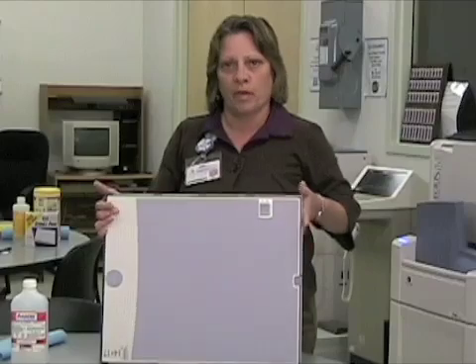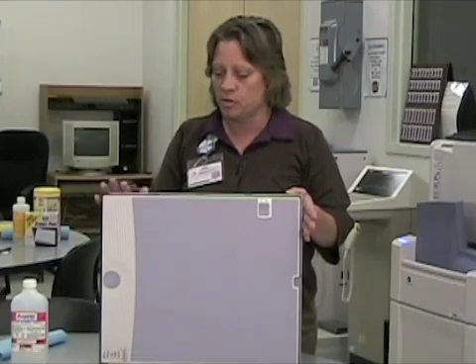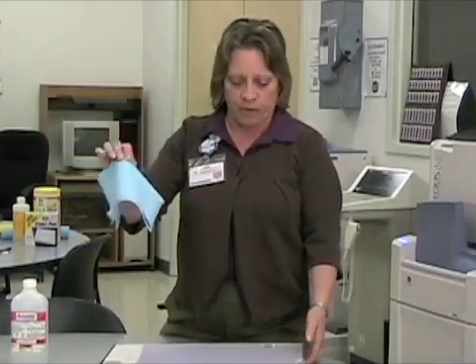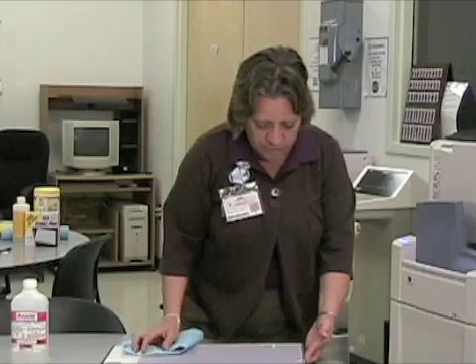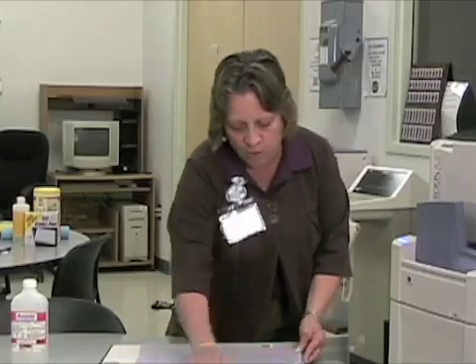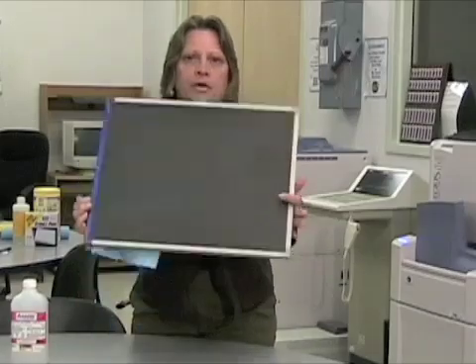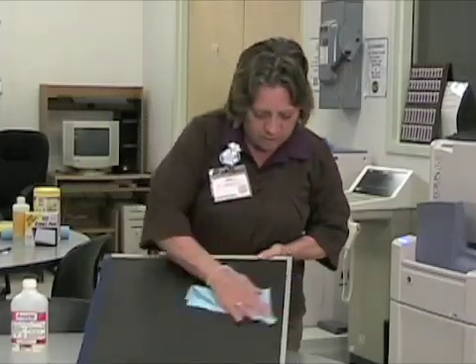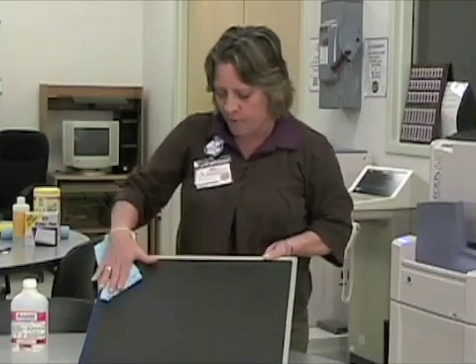When cleaning your computed radiography cassettes, simply use a dry, soft, lint-free cloth on the outside. Just wipe your surfaces really well with a dry cloth. You don't want to use any commercial cleaners or anything on it — just wipe them off.